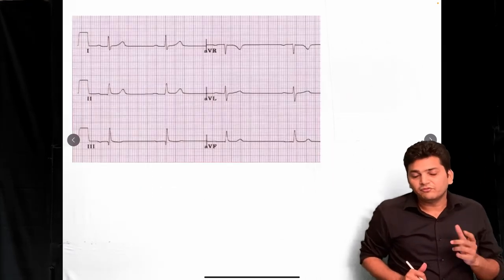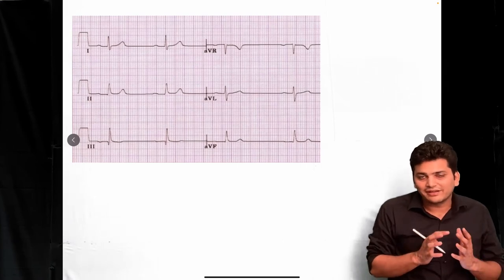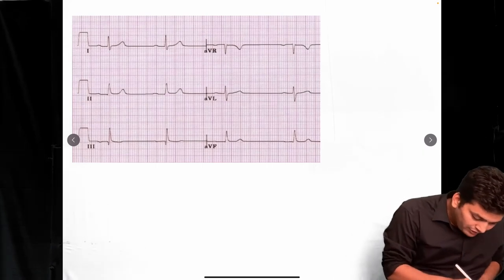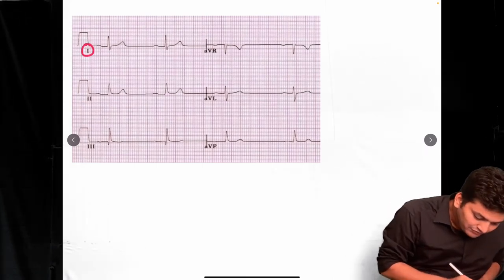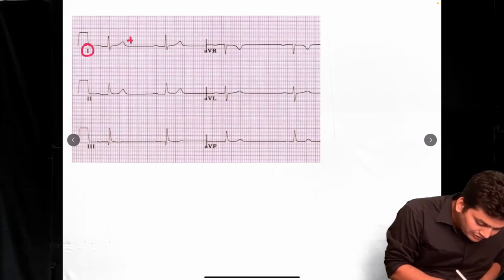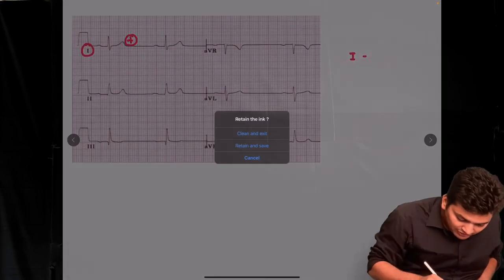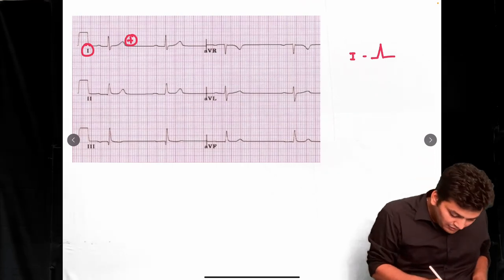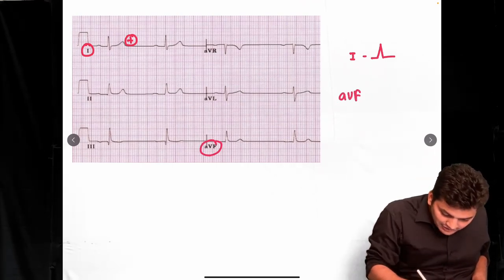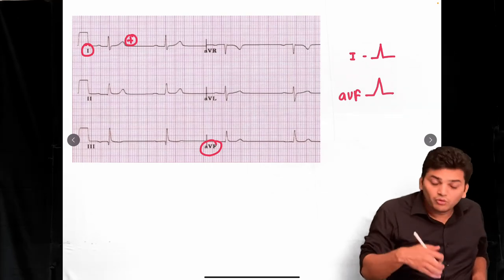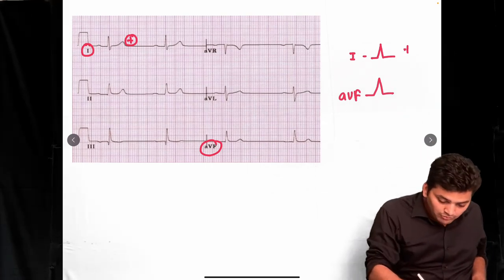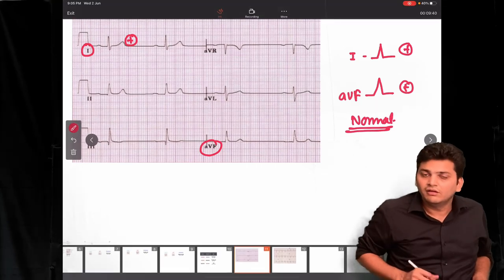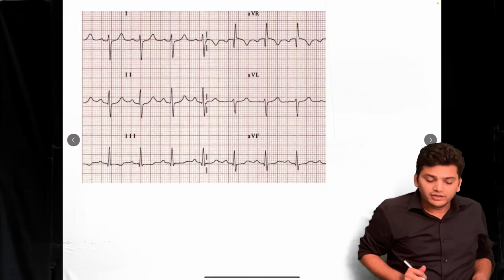Let's look at an ECG and find out whether it is right, left, or normal axis. You can pause the video and find out. In this first example, Lead I shows a positive deflection — the R wave is bigger. When it comes to AVF, the R wave is also bigger. Both are positive, so this is a normal axis.